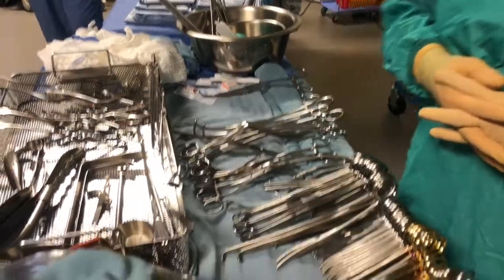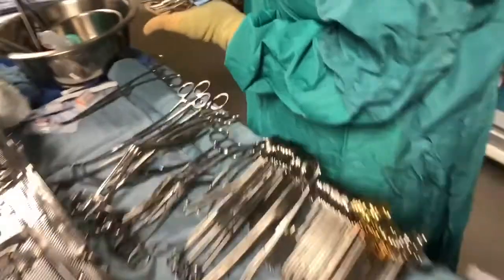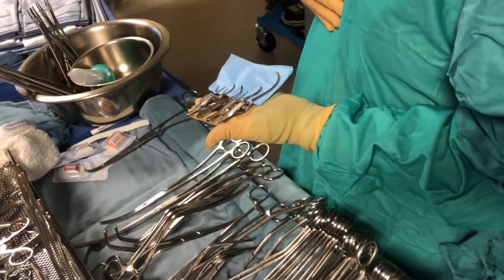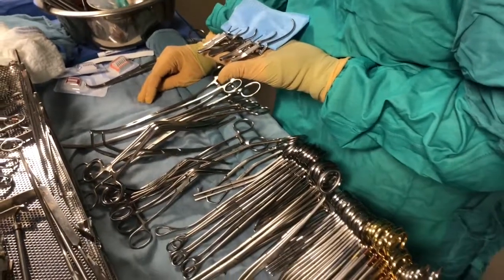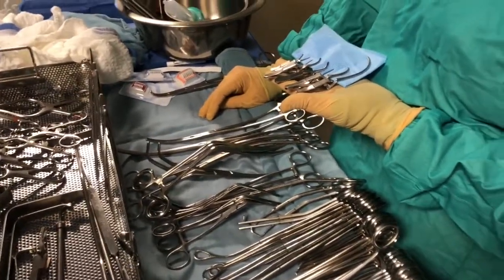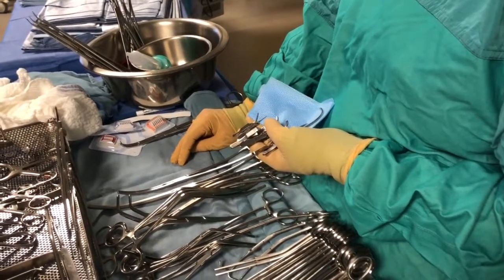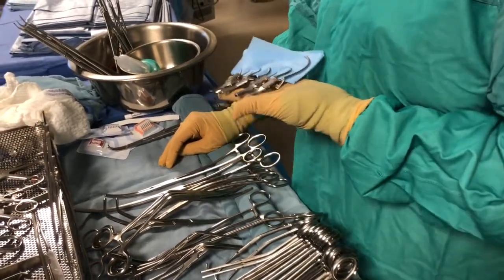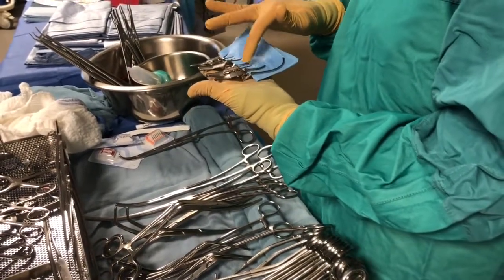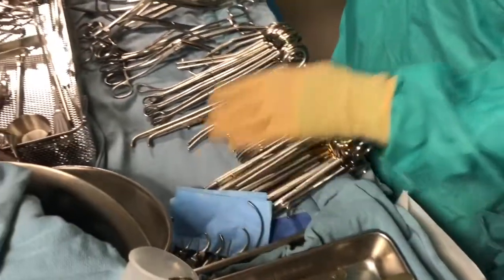Okay, so we still got Blaylocks. They're 1, 2, 3, 4, 5, 6, 7, 8. They'd be in the vascular, pretty sure. Oh, you know what? They're on the other side. For some reason they have the Blaylocks on the small. Yeah, there's 1, 2, 3, 4, 5, 6, 7, 8. Okay, 8. Takes a bit of time, eh?